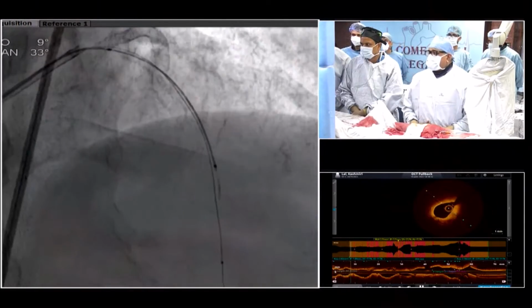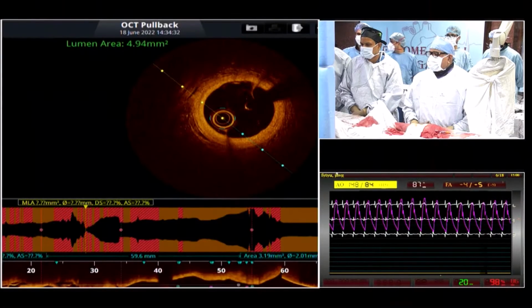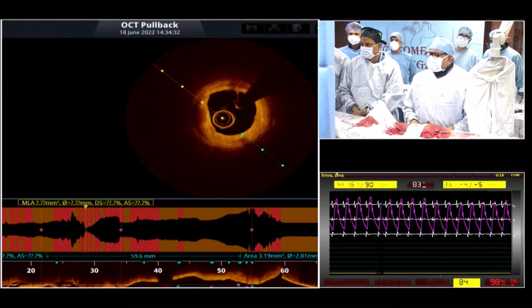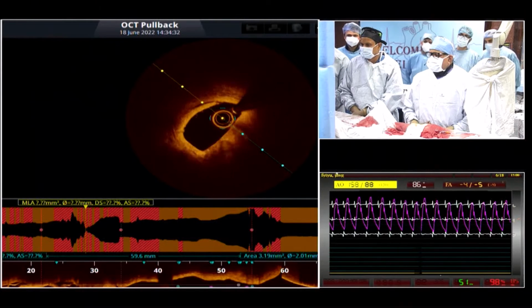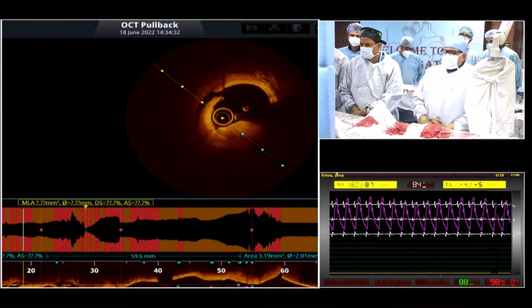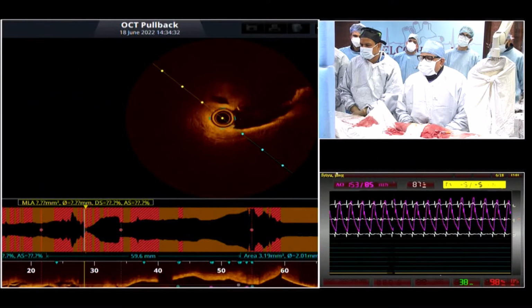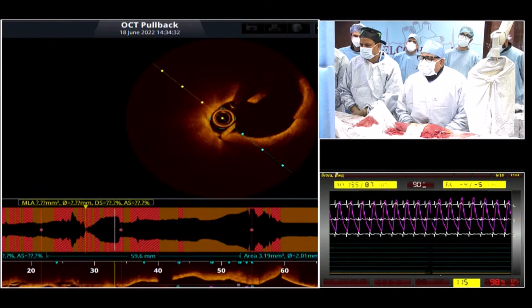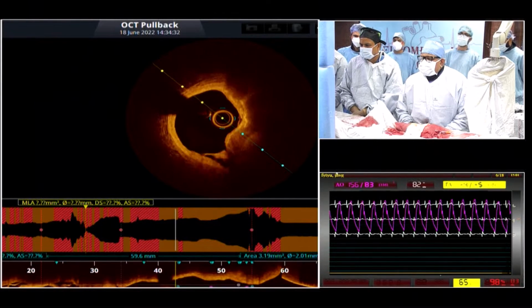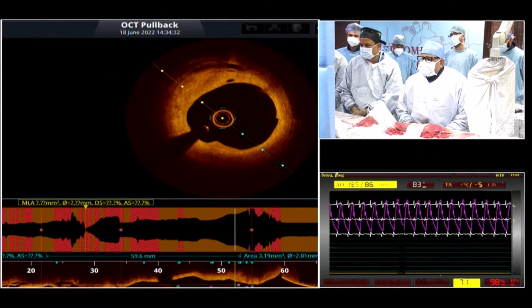Sir, I want to ask a question, Dr. Gambhir. Have you ever seen a change of visible calcium on the fluoroscopy screen after you do rota? We know that it can change on OCT, but have you ever seen it changing on fluoroscopy? It does not. Because basically what you are trying to ablate is only, you are only trying to produce cracks in the intima. And a little bit of cracks helps you to expand the stent. But if you ask me fluoroscopically, does the calcium intensity or the extent or length change? No, it doesn't.